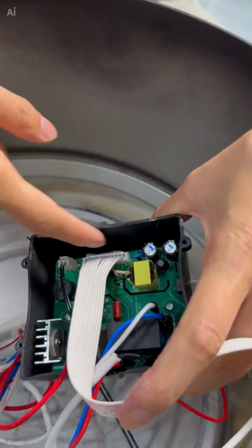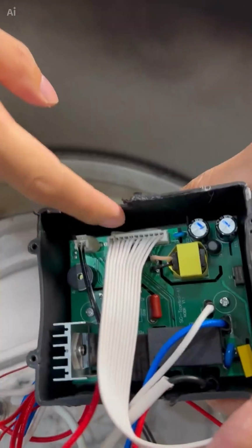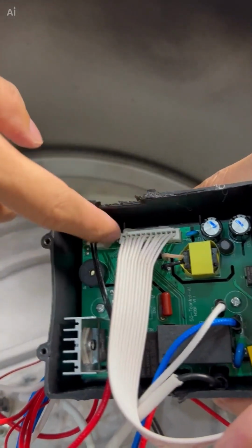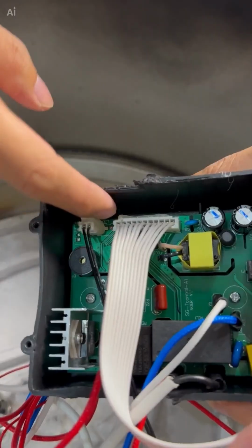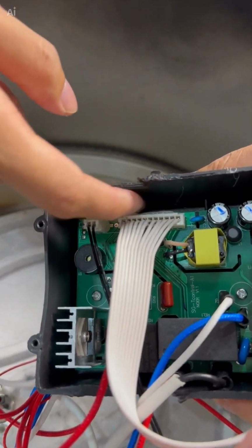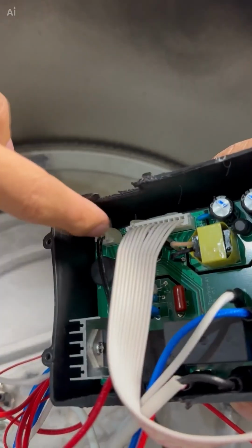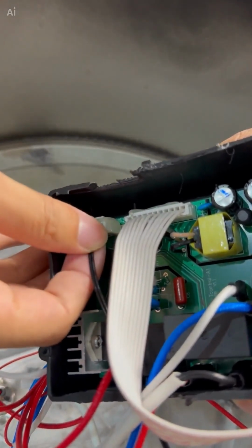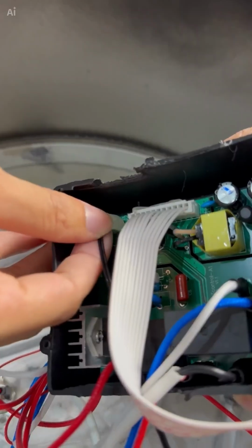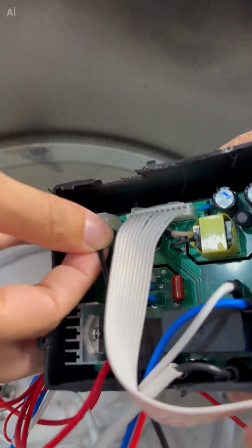After applying the hot melt glue, you need to check here. One thing is to see if the connector of the ribbon cable and the connector of the circuit board are completely covered by the hot melt glue on both the top and bottom terminals. Similarly here, the hot melt glue needs to cover both the upper and lower terminals to ensure a secure connection that won't fall off or fail.